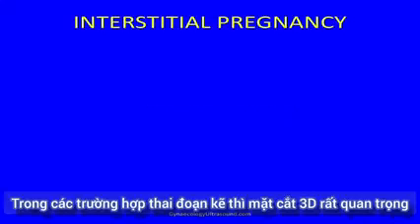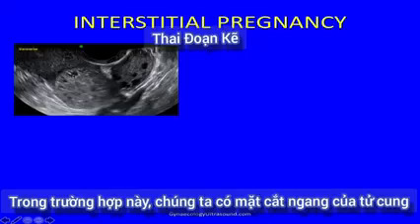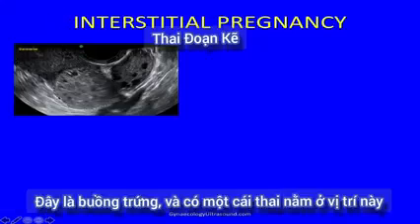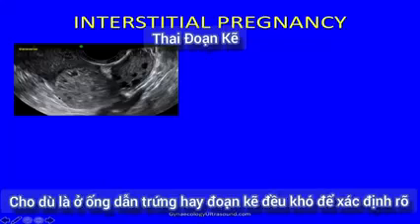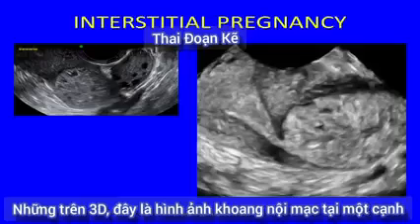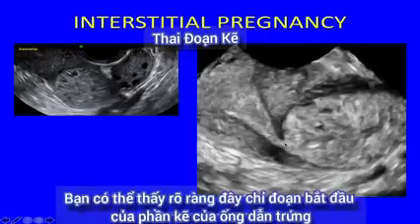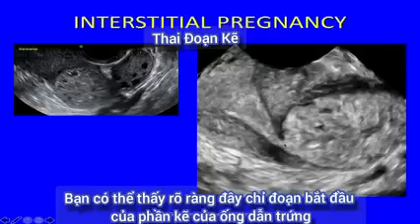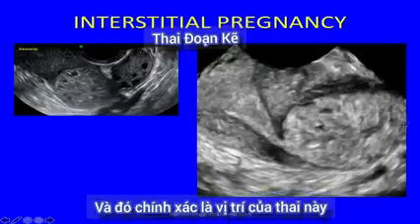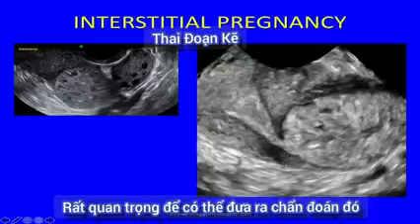In interstitial pregnancy the 3D view is very important. In this case there's a transverse view of the uterus, there's the ovary, and there's a pregnancy located in this position — so whether it's tubal or interstitial is difficult to be certain of. But on 3D, this is the endometrial cavity to one edge, and you can clearly see that this is just the beginning of the interstitial portion of the fallopian tube — and that is exactly where this pregnancy is located. So important to be able to make that diagnosis.